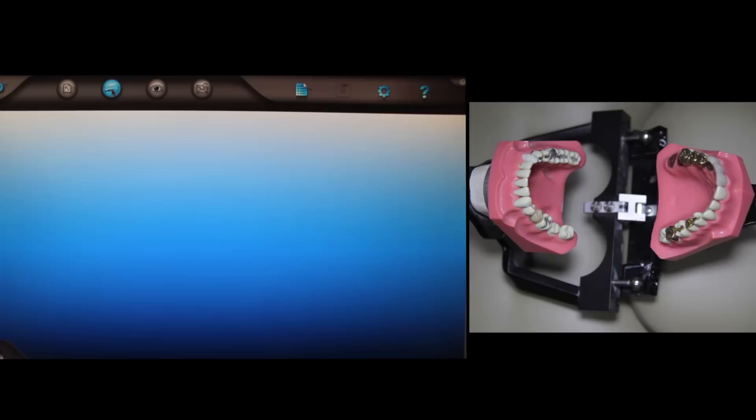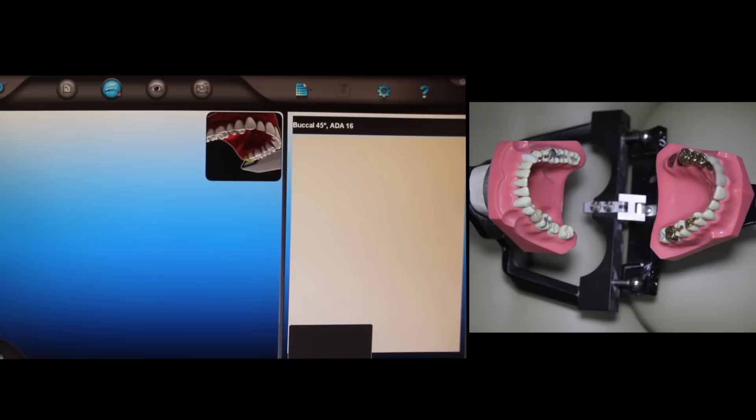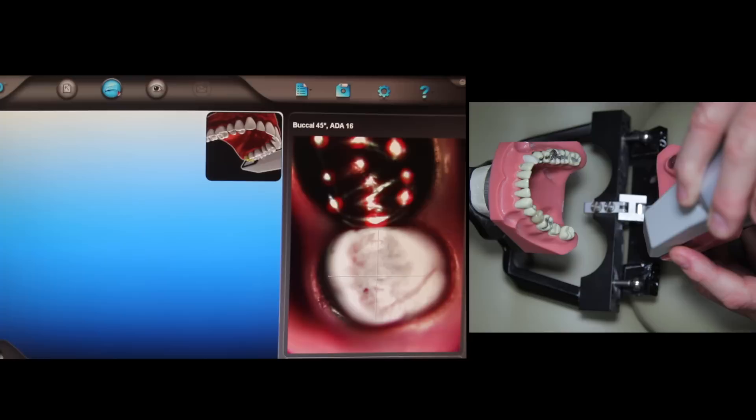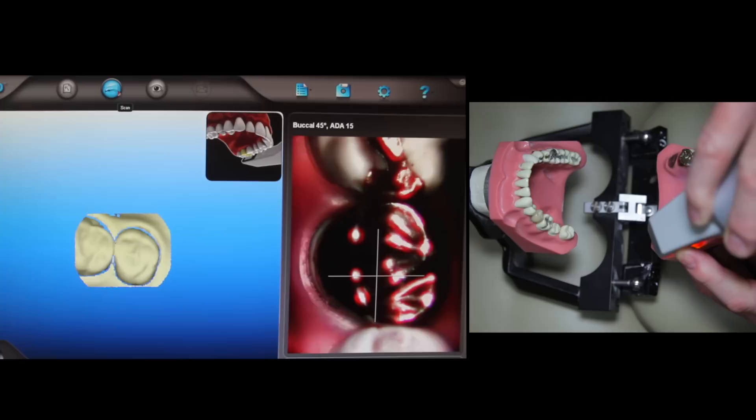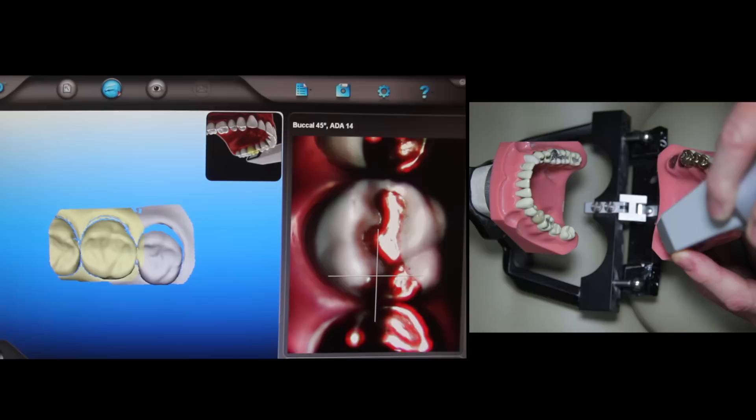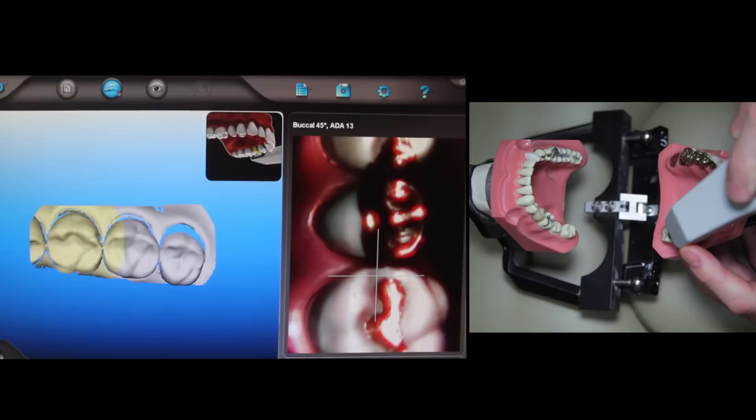As I start this process, you'll hear the computer telling me exactly what to do and I just have to follow it along and carefully hold it still while it takes all its images. Every time you hear that beep there's a hundred thousand points of laser light that are being sent out and reflect back into the little sensor that you're seeing right here. And that's what's creating that image virtually on the screen in three dimensions.